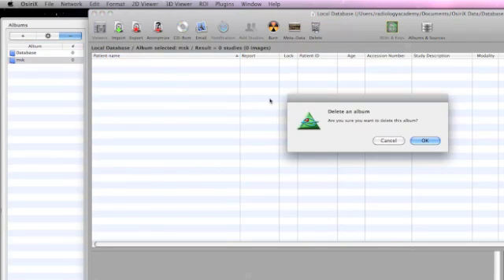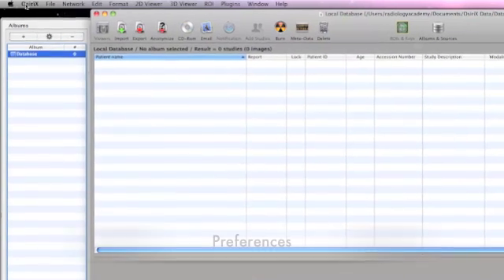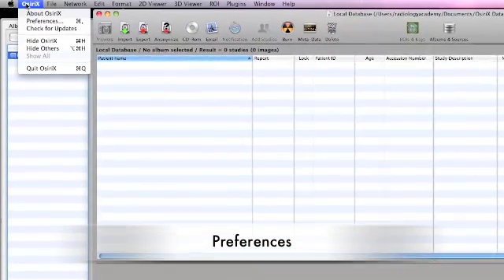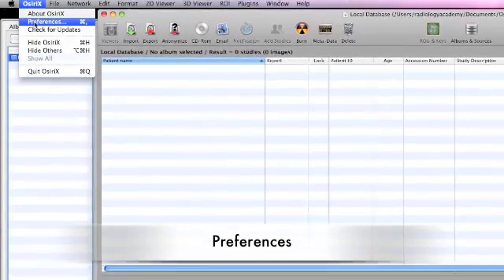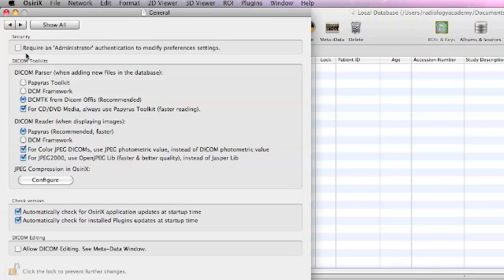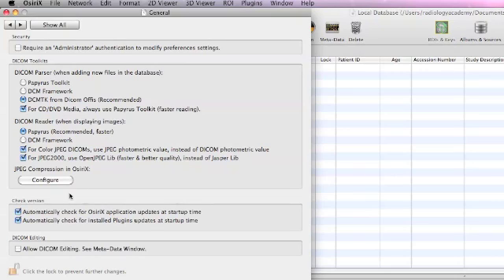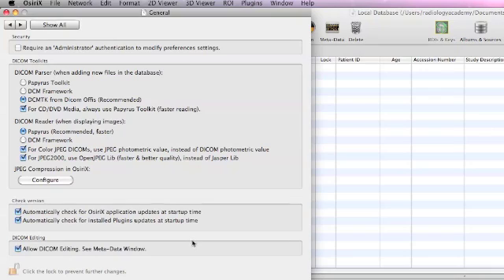Moving on to preferences. If we look in the general preferences folder under OsiriX, which will be useful to modify when we first set up the database, under the general setting we look at DICOM editing. Usually unchecked is the allowed DICOM editing. It's important that we check this because this will allow us to edit CT stacks and modify the number of CT images in the stack.